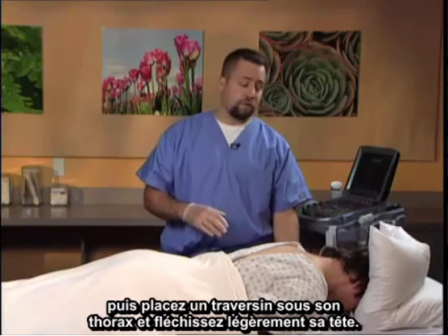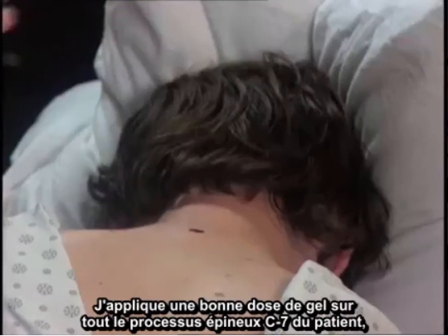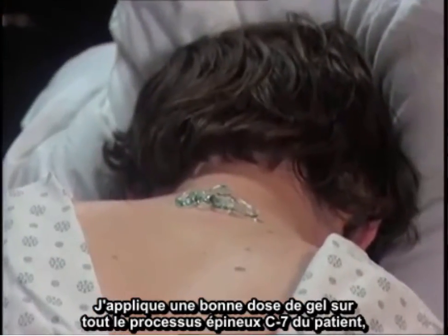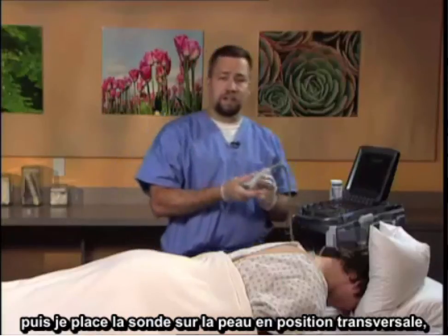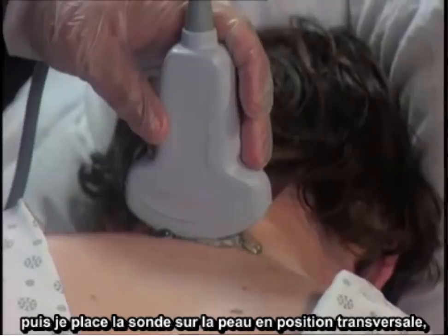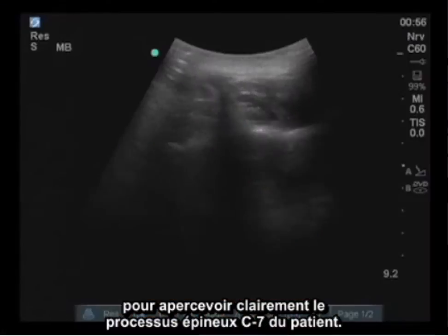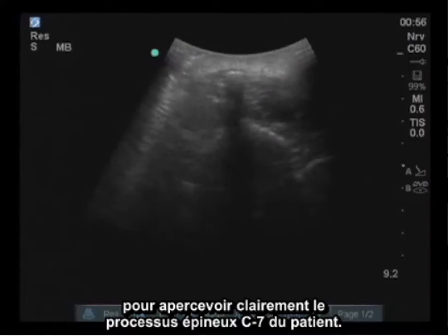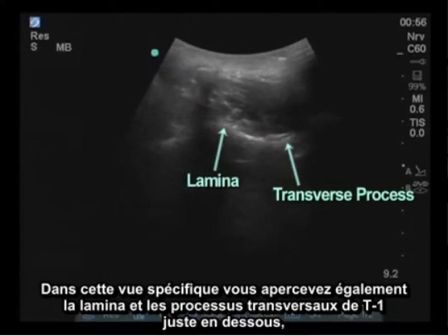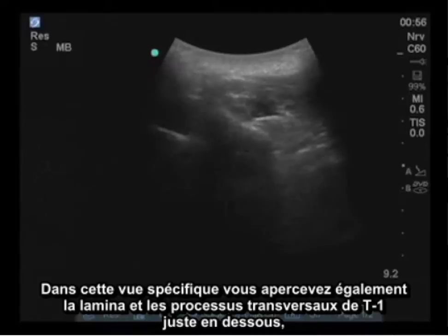A bolster is placed under the thorax and the head slightly flexed. I place a copious amount of gel across the patient's C7 spinous process, then utilizing the probe in the transverse — that is the left to right positioning — I place contact on the skin. Clearly visible is the patient's C7 spinous process, as well as the lamina and the transverse processes of T1 just below.